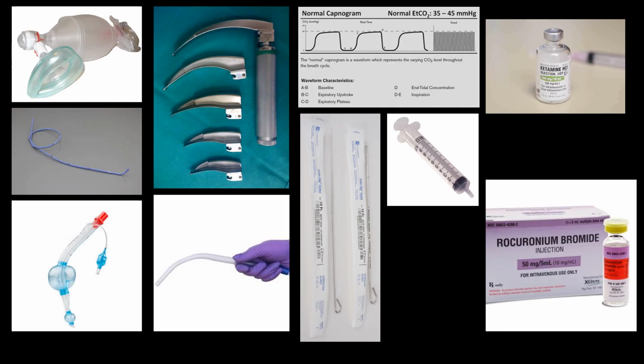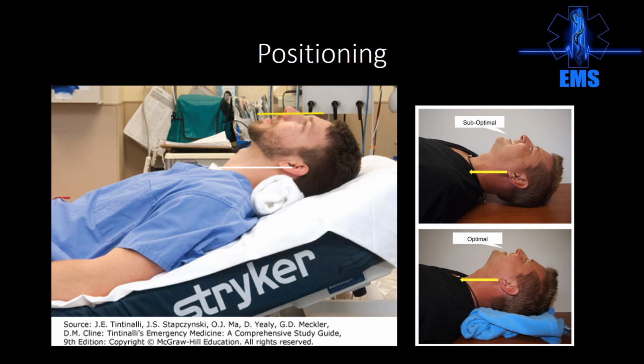And then if you see, I'm sure you've all seen the end-tidal CO2, but that's what I was talking about. Sharp incursion or sharp upslope, followed by the plateau, followed by a sharp deceleration and drop-off. You don't want the shark fin. Shark fin is indicative of people who are stacking breaths, who have auto PEEP, and those are going to cause you problems during that transport. The patient's going to become either hypoxic or hypotensive.